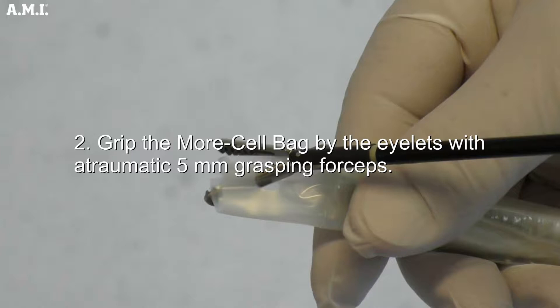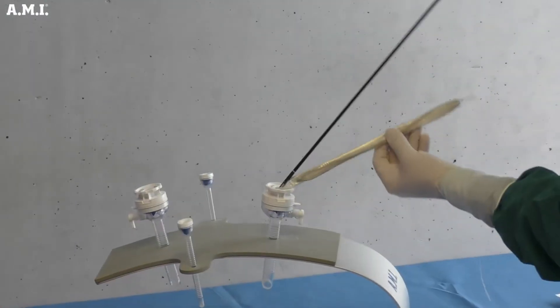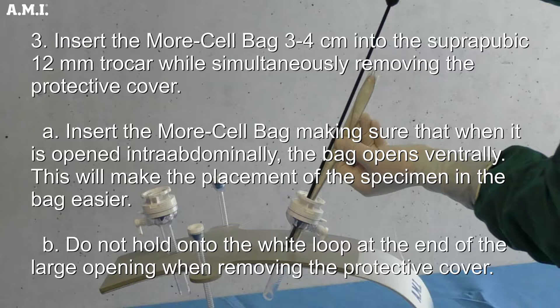Grip the More-Cell bag by the eyelets with Atraumatic 5 mm grasping forceps. Insert the More-Cell bag 3 to 4 cm into the suprapubic 12 mm trocar while simultaneously removing the protective cover. Ensure that when the bag is opened intra-abdominally, it opens ventrally — this will make placement of the specimen in the bag easier. Do not hold onto the white loop at the end of the large opening when removing the protective cover.